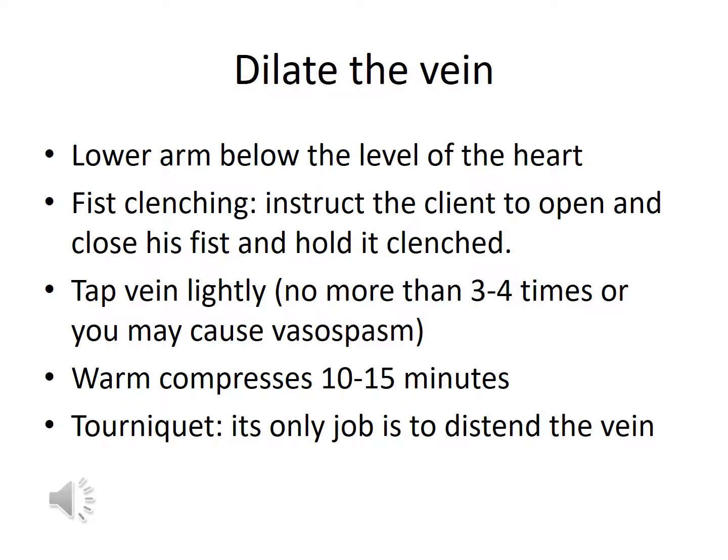To dilate the vein, you should lower the arm below the level of the heart. You can have the client close their fist. They don't need to pump it. Sometimes this opening and closing gives the patient something to do, especially if they're nervous or anxious. But simple fist clenching will do the job.